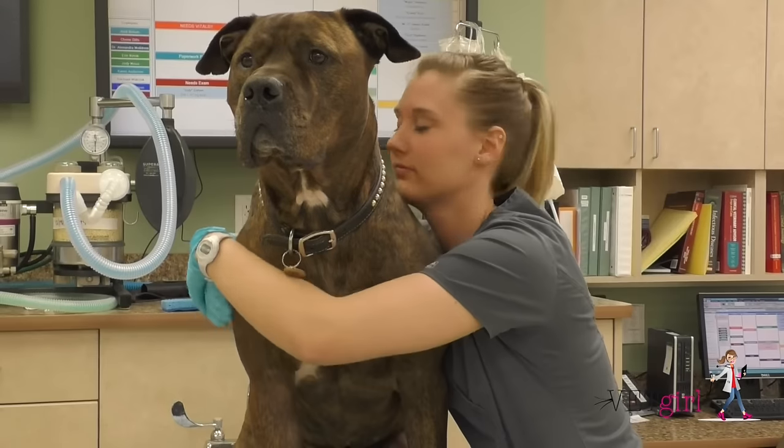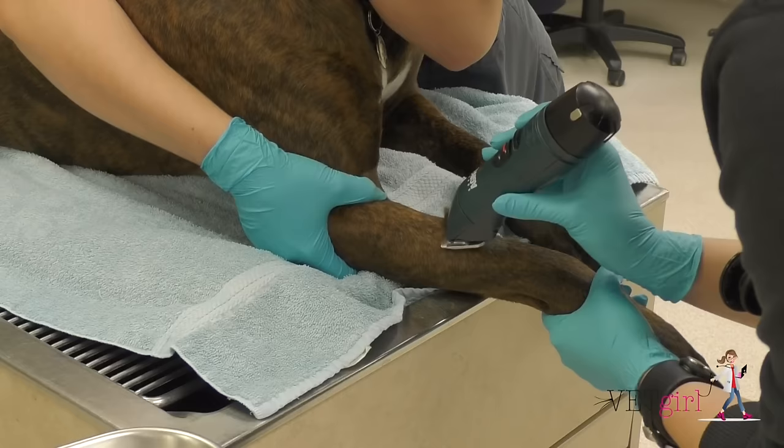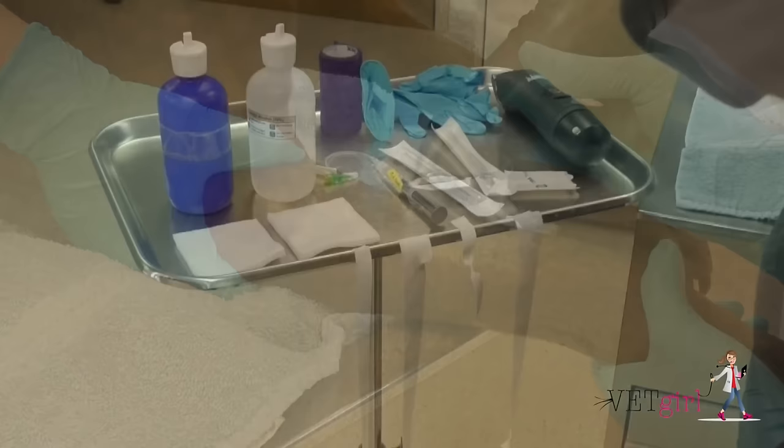In this VetGirl video, we demonstrate how to place an intravenous or IV catheter. This is a common daily procedure that veterinarians and veterinary technicians must feel comfortable performing.